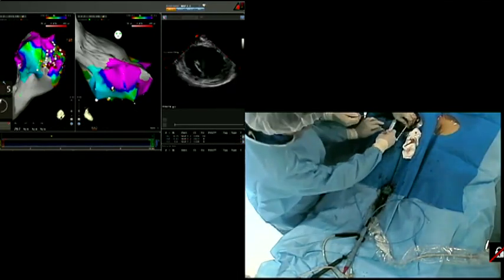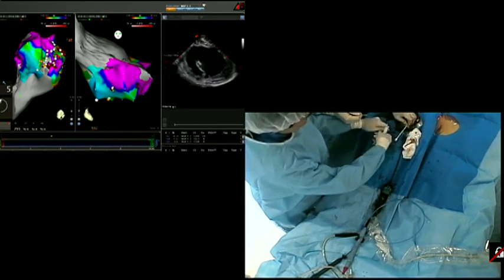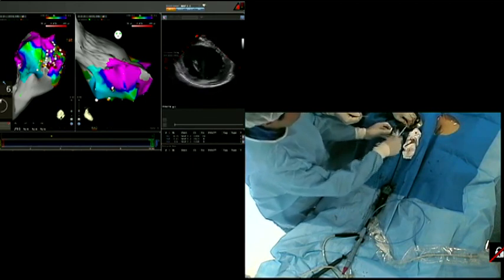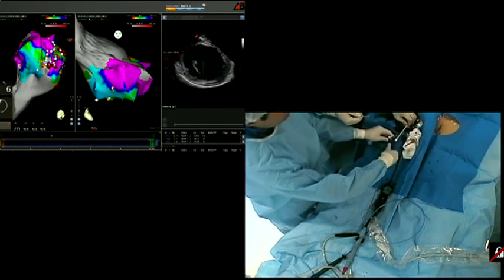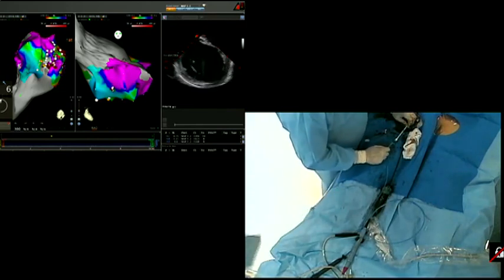Activate the penta. Video and we'll do the closing. Is that okay, or what do you want to do? Yes, okay. Is that fine? Okay. 'Cause I think, unless you guys want to stay. Yeah. Yes, you can irrigate the sheath now.